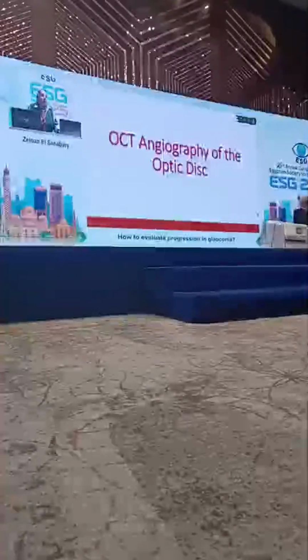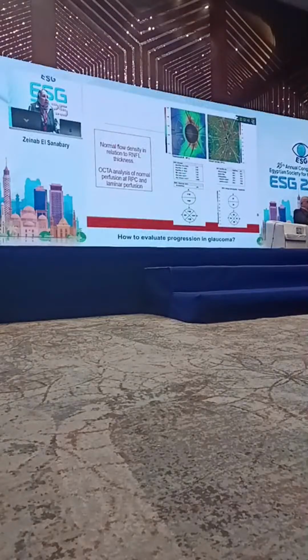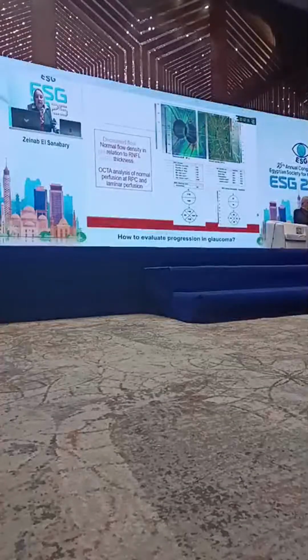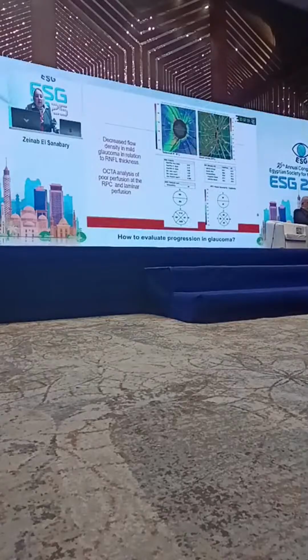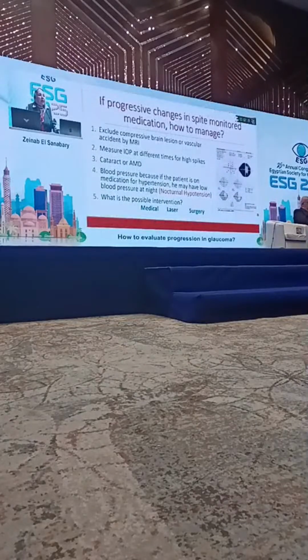So what do I do? Maybe we have hope with OCT angio. As Professor Shima has demonstrated, OCT angio will measure vessel density. I have no normative data, but I can follow if the vascular density diminishes on different exams. So this may be used as a progression indicator.